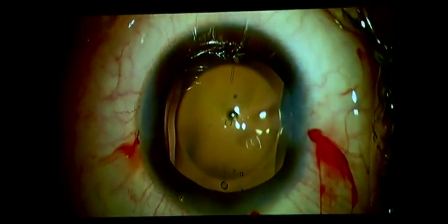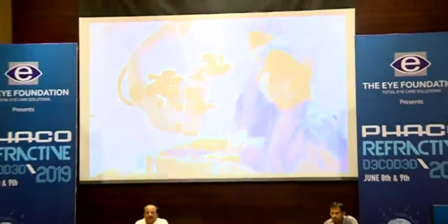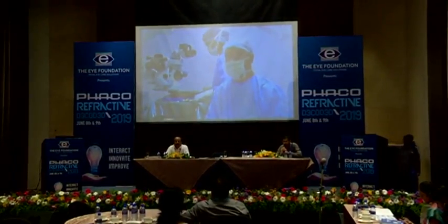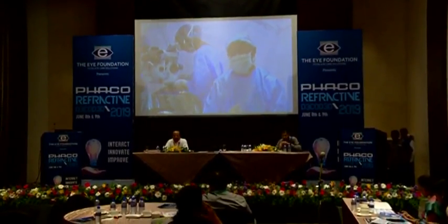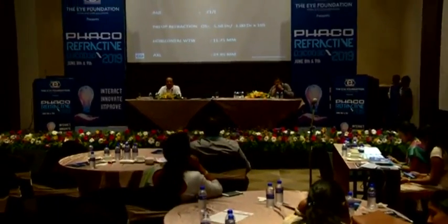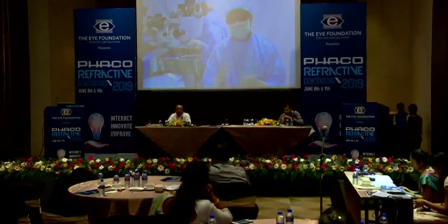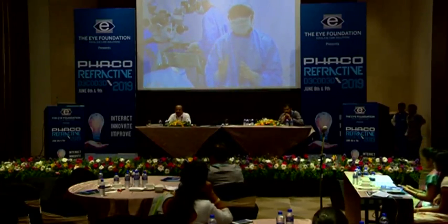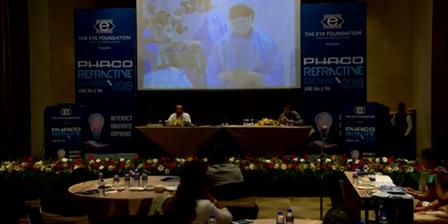Thank you, Dr. Tityal. That was a wonderful surgery. So do you use pilocarpine after surgery? No, I don't use pilocarpine in these cases because that is not desirable at all. Because you have an aquaport and you have done a nice viscoelastic removal, the pilocarpine is not desirable. Normally I see my patient after 2 hours of surgery and check the intraocular pressure. If I have not done intraop OCT, then I get an ASOCT done immediately afterwards to see the exact position of the lens. It is important to check your IOP and vault within the first few hours so that if you have to do something, you can do it immediately.